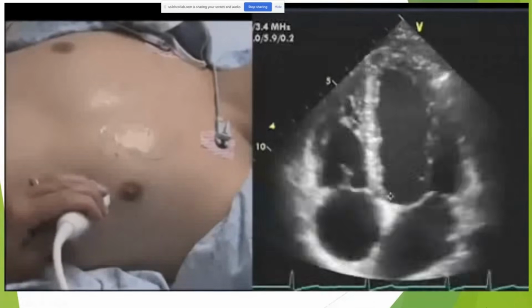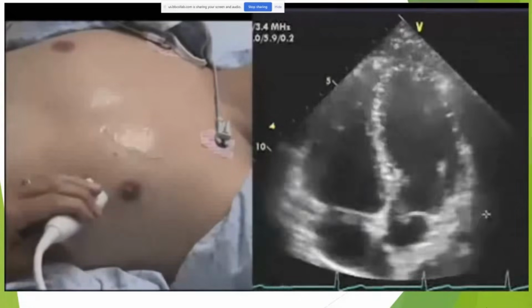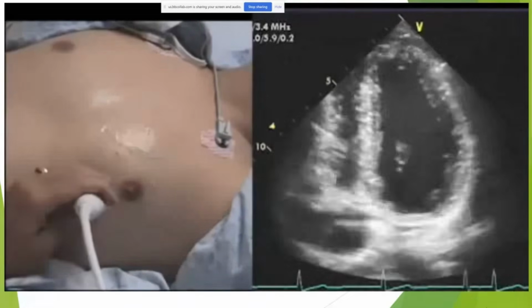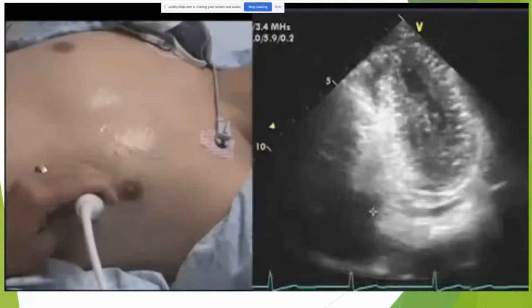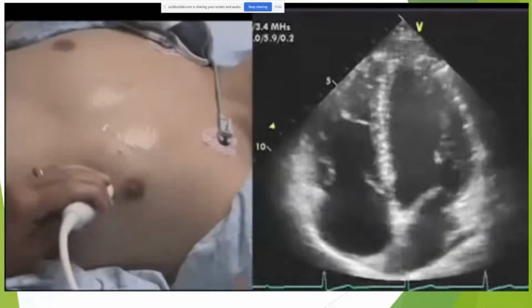With no aorta, no coronary sinus, that means we have a good apical four-chamber view. Again, too anterior, the aorta comes in. We go towards the apical five-chamber view. Too posterior, coronary sinus comes in. And that means we're too posterior, and that's not a good apical four-chamber view. So that is the best apical four-chamber view right there.